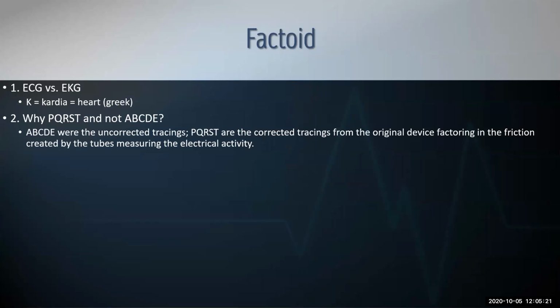I kept this in from last year just to understand why we say ECG versus EKG. It's basically the Greek translation of cardiac. And then the reason why we do PQRST rather than just starting from A through E is really because when they were initially developing the EKG, there was a lot of friction generated by the leads themselves. So when they corrected the findings for the actual friction that we saw, they used the letters PQRST, and that kind of stuck.